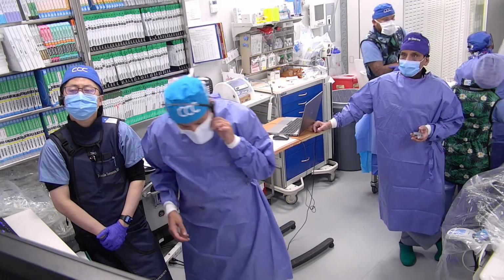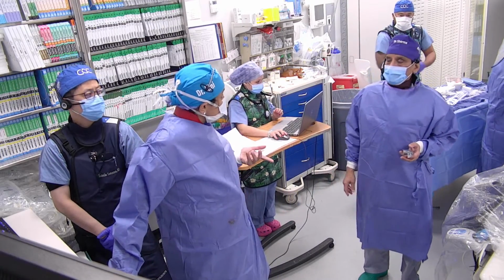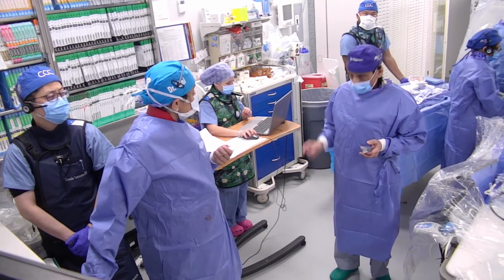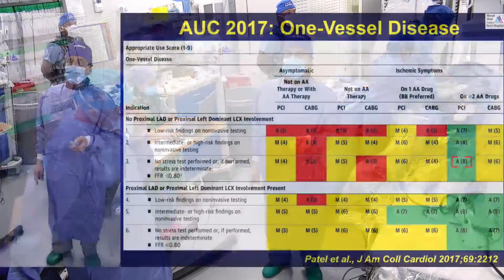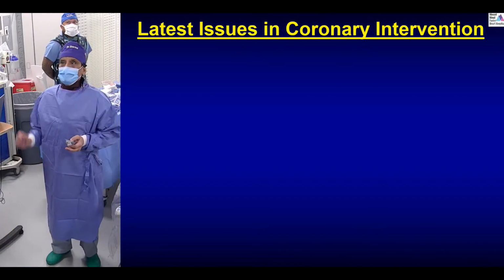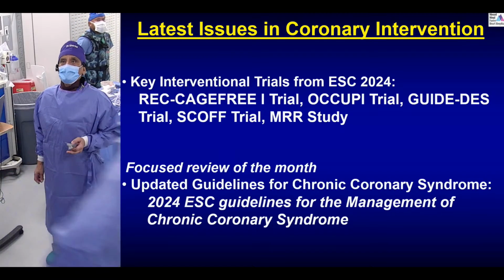And there also we will require a lot of imaging gurus to give some opinion. Any other questions you said? No, you said there were a lot of questions came, about the distal dissection. 5 questions in the last 30 seconds. Yeah. If we can go to our slide presentation, this we have done. But are they okay with our answers? Yes, completely happy, completely satisfied now.